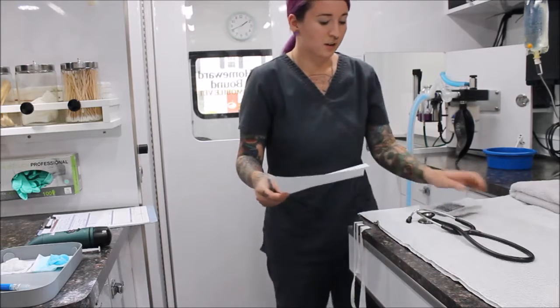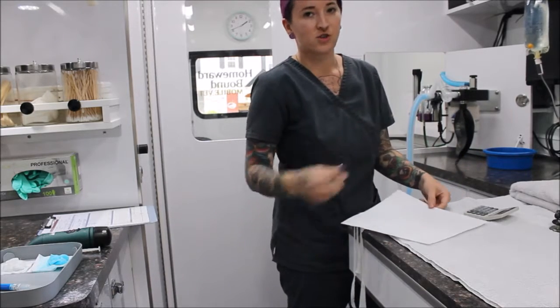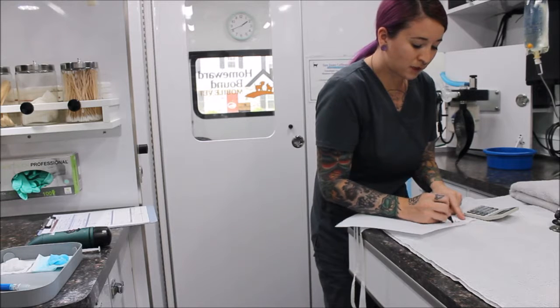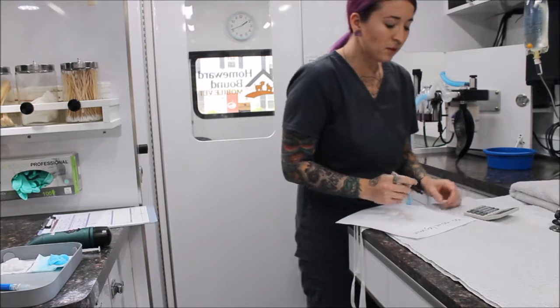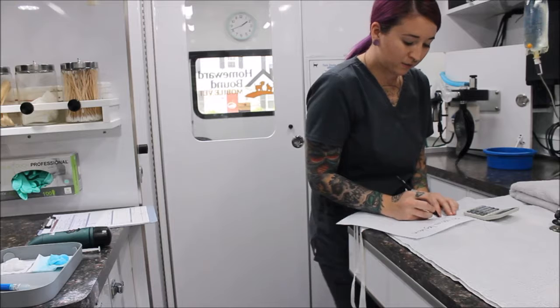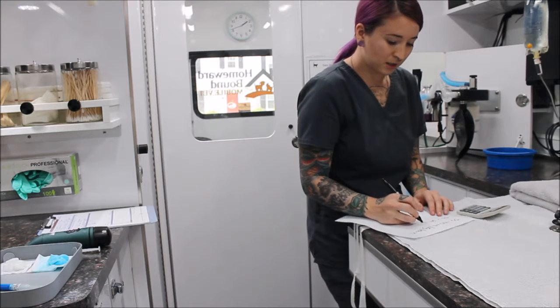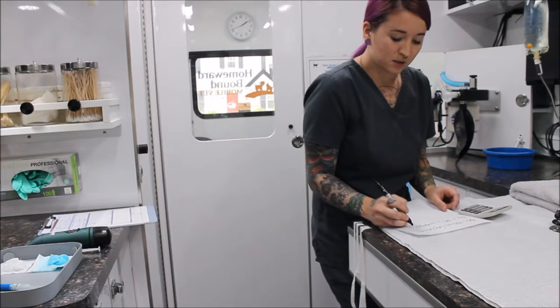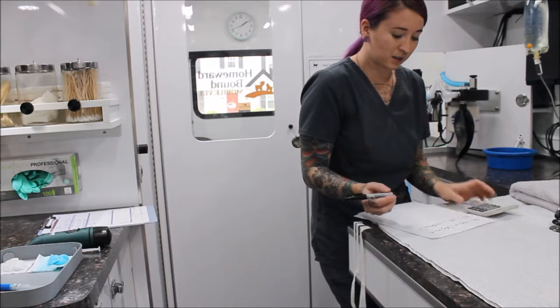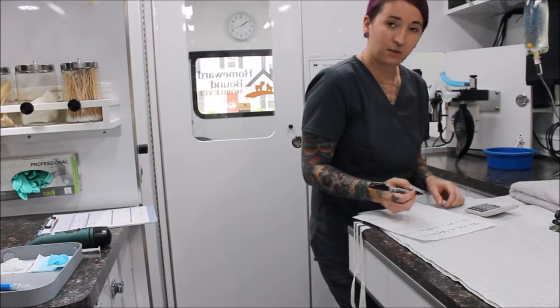So what I'm going to do is calculate the oxygen rate for him. Usually for induction and recovery, or during changes of anesthesia, we'll do like a 50 to 100 ml per kilogram per minute. So we'll go ahead and just calculate the 50. So we'll do 50 times 29, which is 1,450 milliliters. So then we'll basically transfer that into liters, which is 1.4 liters of oxygen per minute.